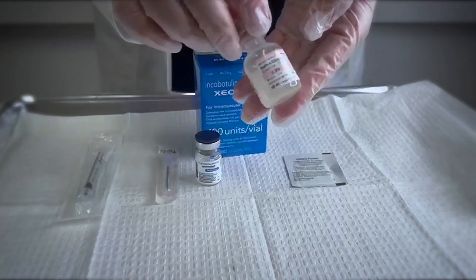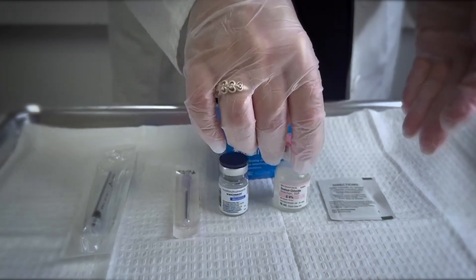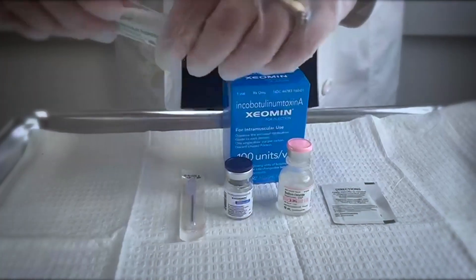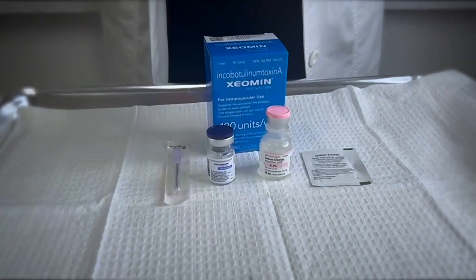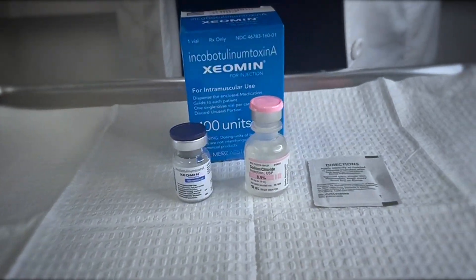Supplies needed for the dilution: 0.9% normal saline, a 1 or 3 ml syringe, an 18-gauge needle, and alcohol wipes.